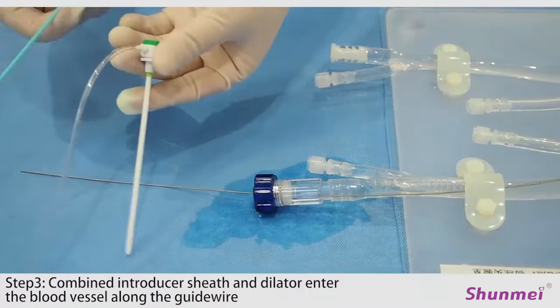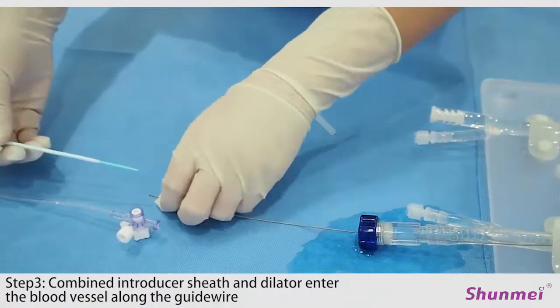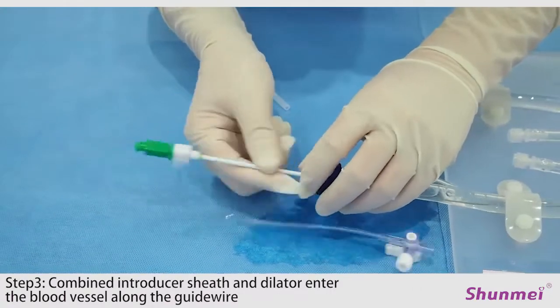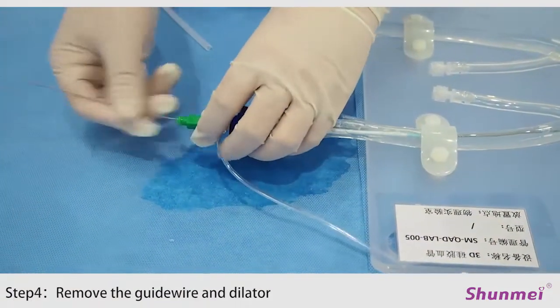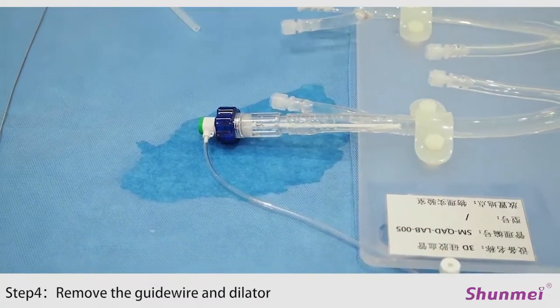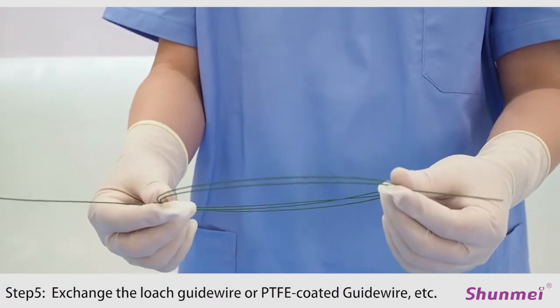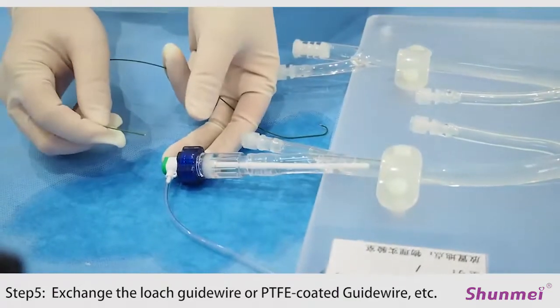Introducer sheath and dilator need to be combined and inserted together, so the dilator is inserted into the introducer sheath first. After the combination is completed, it is introduced into the human body along the guide wire. After the insertion, remove the guide wire and dilator, thus establishing a channel between the inside and outside of the body. Next, we will insert a PTFE-coated guide wire, usually a 0.035-inch PTFE-coated guide wire.